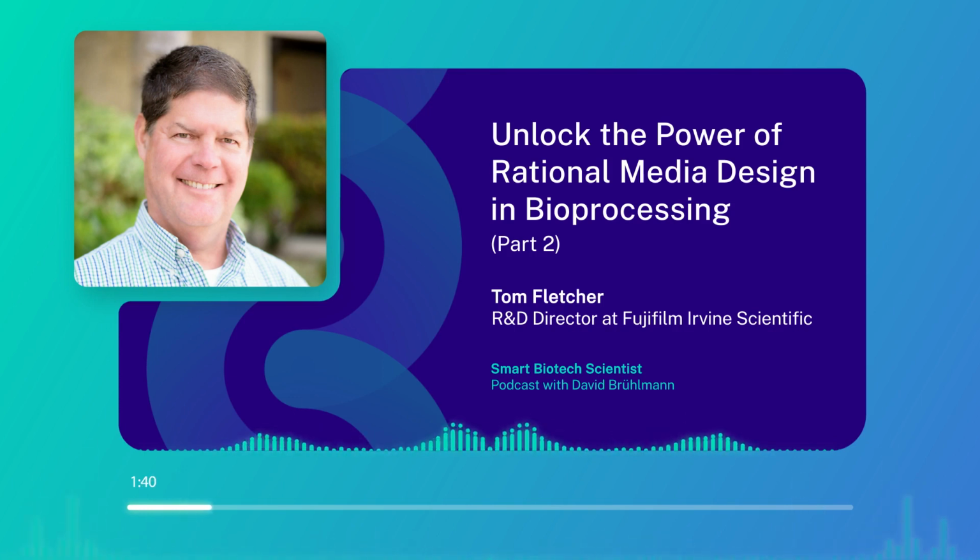Yeah, I think there are some simple steps, and I've kind of thought them through because I knew we'd be talking about this. So I really think that you begin with carefully defining what your goals are. Surprisingly, I guess it sometimes gets skipped over because maybe everybody assumes, of course, we just want a better process. We want more performance. We want better cell growth, all of these things. I think we need to stop and think about, in the particular process that we're trying to develop, what really are the needs? What are the goals that we have?